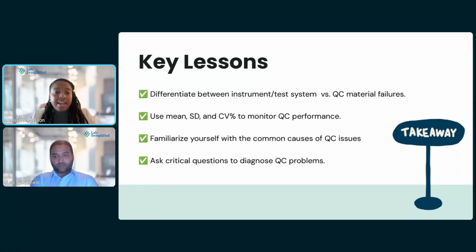But a QC log is extremely important as well. This is kind of archaic, but we had a journal, a little notebook where we wrote out the date and whatever QC issues we had, as well as the troubleshooting steps that we took. It's one of those things where you just have to do it, and you have to have leadership that backs you up.